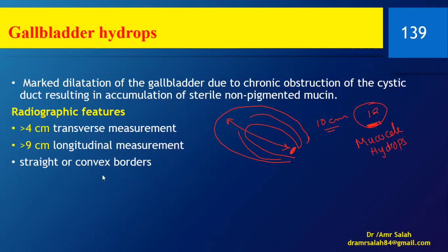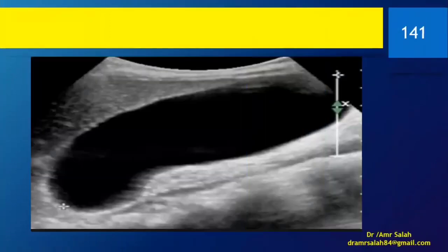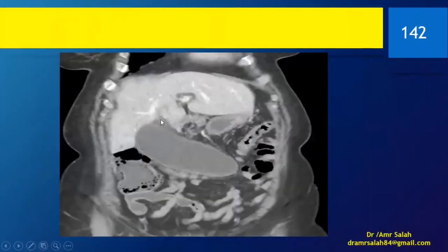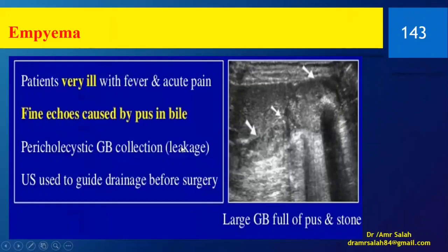The poor gallbladder has become like a balloon, okay. Voila, as such. Look at this. This is very big, definitely more than 12 centimeters. Look at this. Oh la la. This is a very big gallbladder. This is the hydrops or the mucocele of the gallbladder.